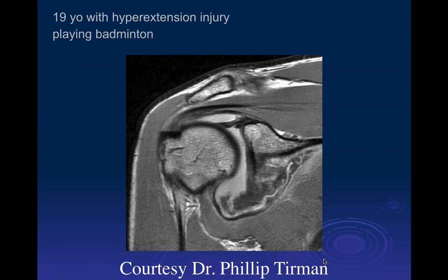It's called also Perthes. Is that what? Well, forget that. Perthes had a lot of lesions, and it gets confusing. The main thing, like John said, is you just need to describe the abnormalities and then say what you think the likely mechanism is in this setting. Well, HAGL is not a name, so you can use HAGL. I think all orthopods will understand it. Yeah. That's just using initials instead of words.